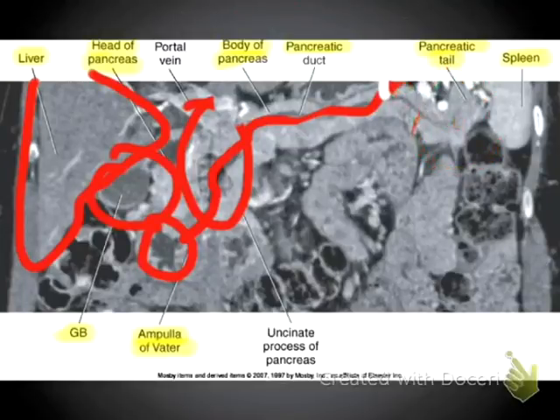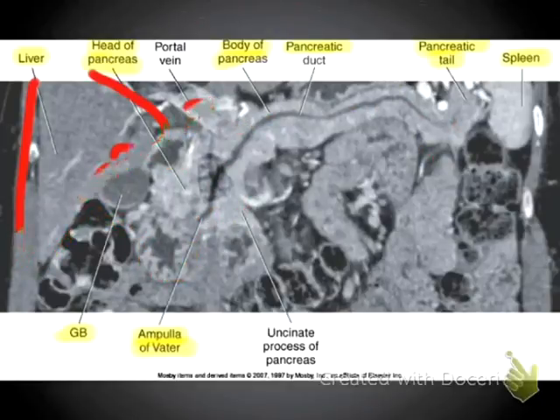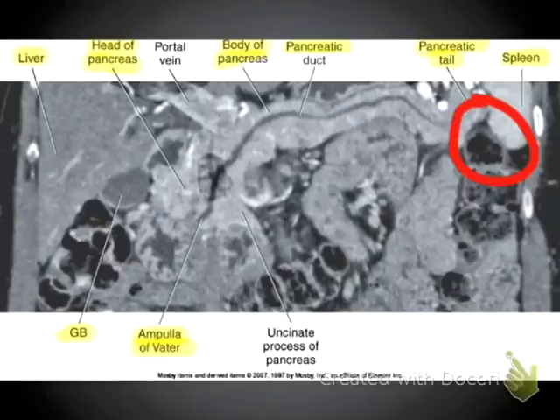Also, we appear to have the splenic flexure over here. And we're probably looking at ascending colon going into the hepatic flexure here as well.